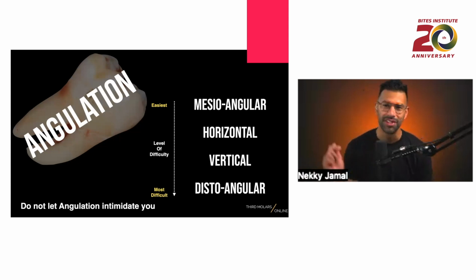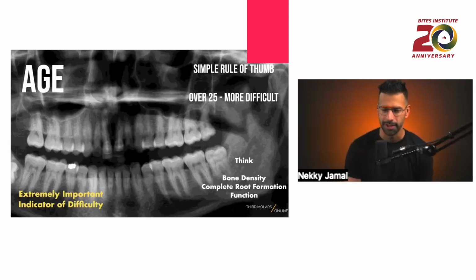And those are the ones general dentists often go for because they can see them and then they get humbled, like I've been so many times. So don't make that mistake. Just don't let angulation intimidate you. You just have to know how to section them properly.